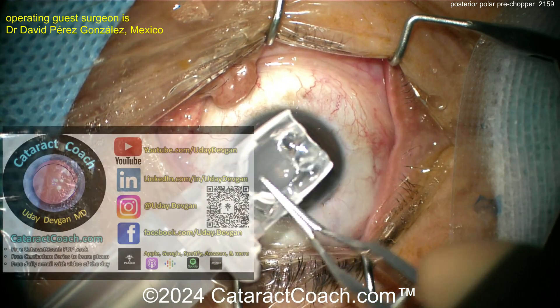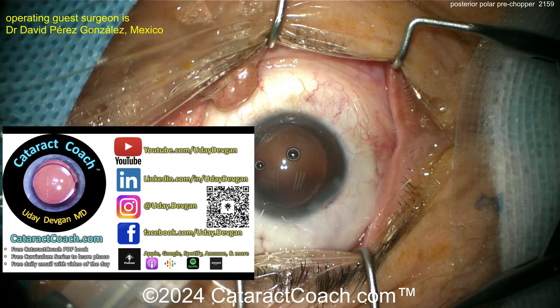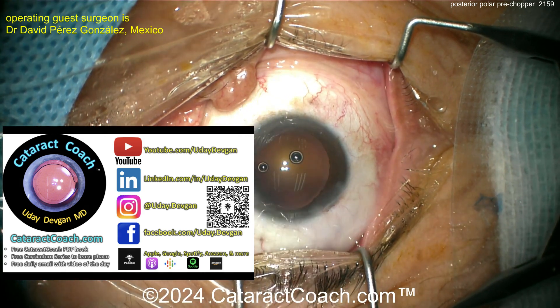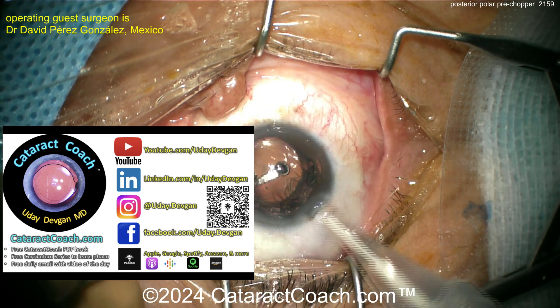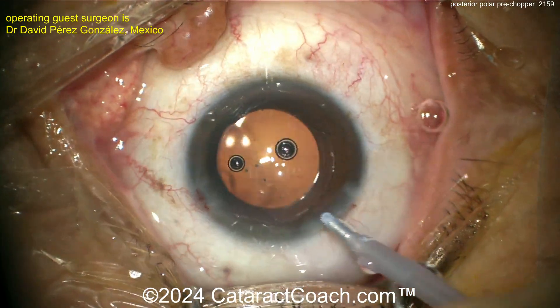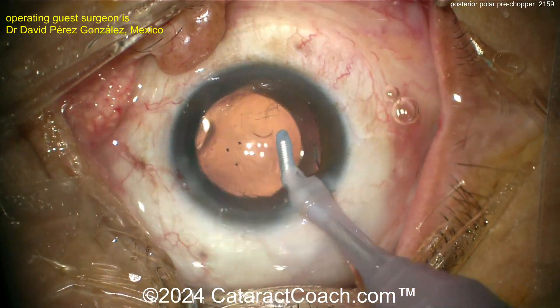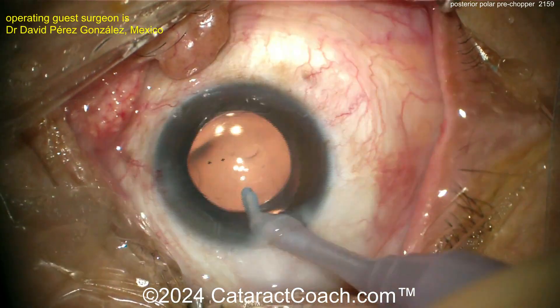Do not polish the posterior capsule. I like to fill with viscoelastic when coming out. Check out our teaching website cataractcoach.com for much more, including our podcast. Now the lens is going in — a single-piece acrylic lens going nicely into the capsular bag — beautifully done. Taking out the viscoelastic — call it a day.